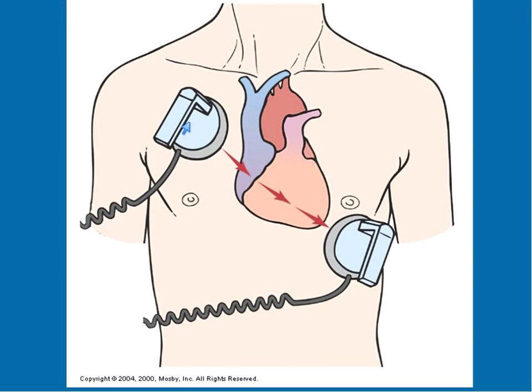Here you have the paddles. We don't use paddles at Christian anymore. I'm sure there are places that use paddles. We put the pads on the patient. One of the things to keep in mind is that using these paddles makes it very obvious what's happening.